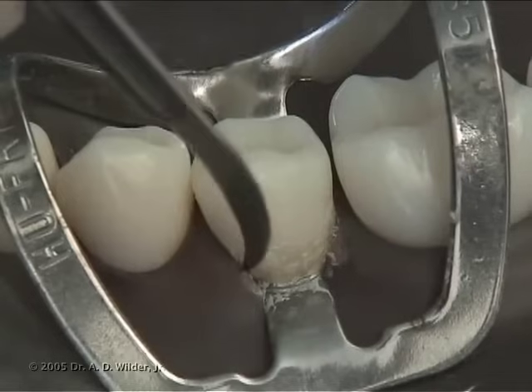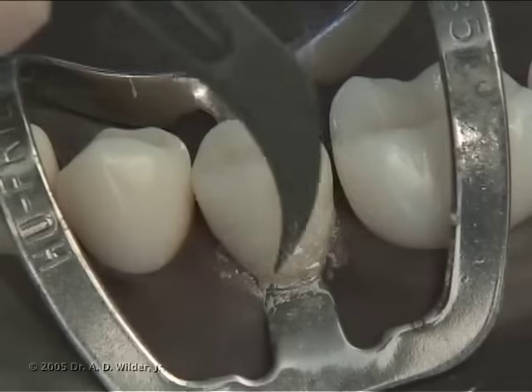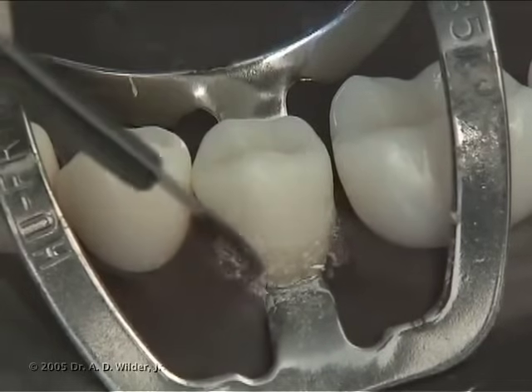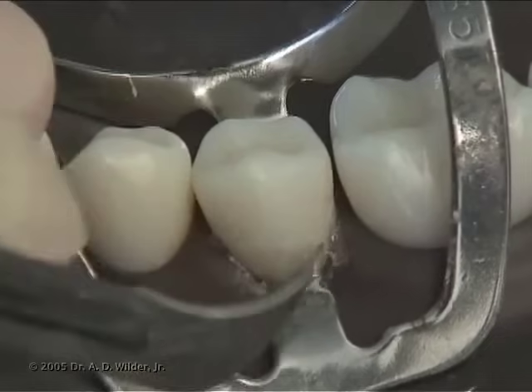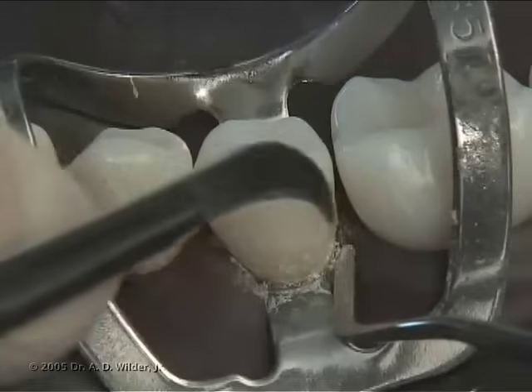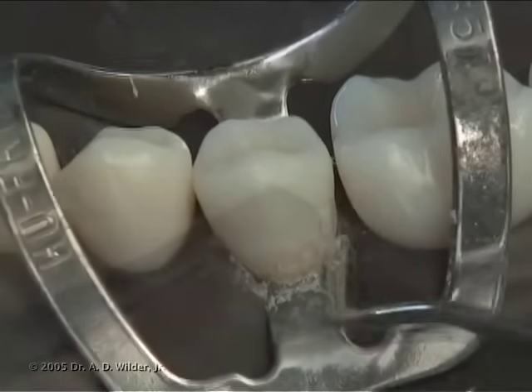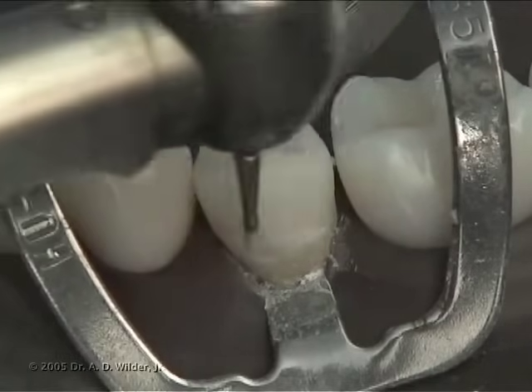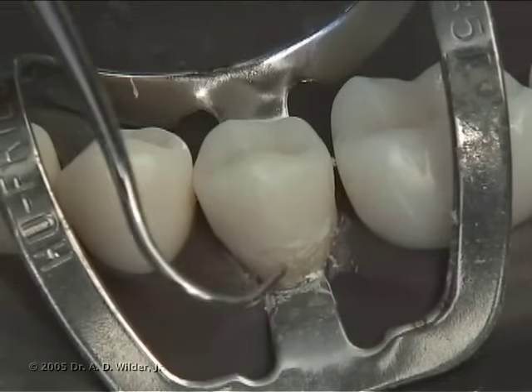Check for flash and any irregularities with an explorer. A number 12 curved scalpel blade can be used to carefully contour and remove flash. Carefully hold soft tissue out of the way as needed. You can verify smoothness with an explorer.